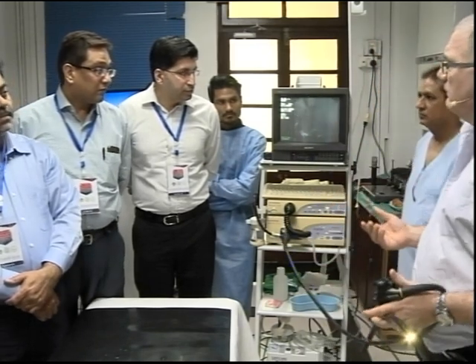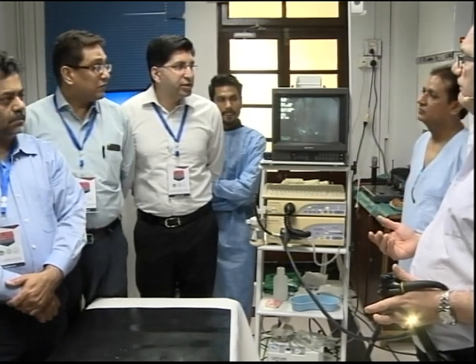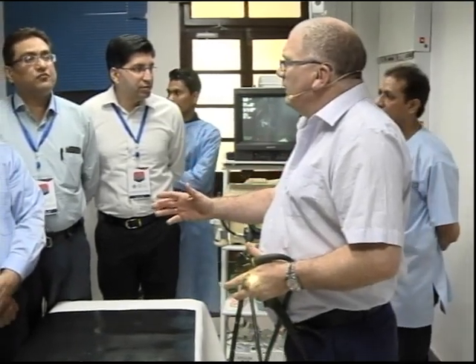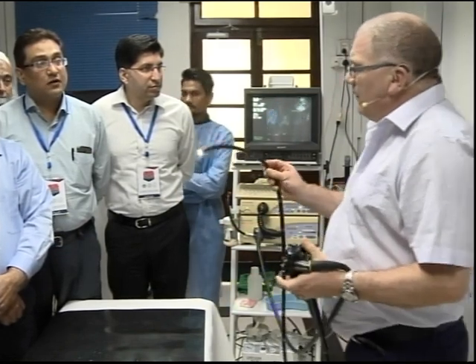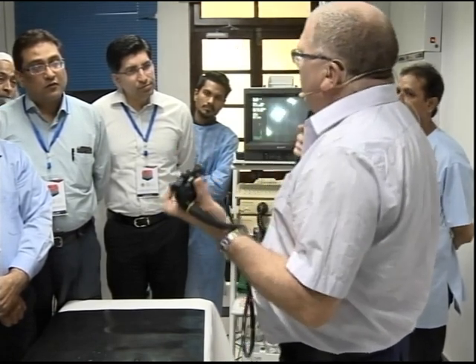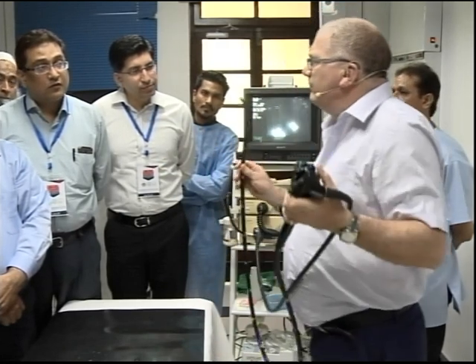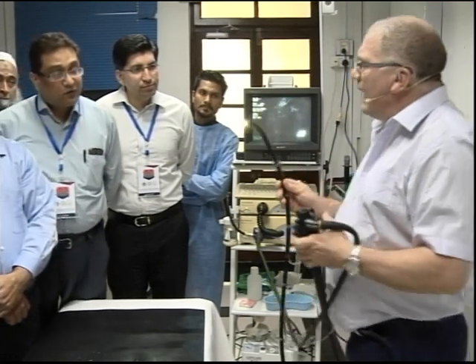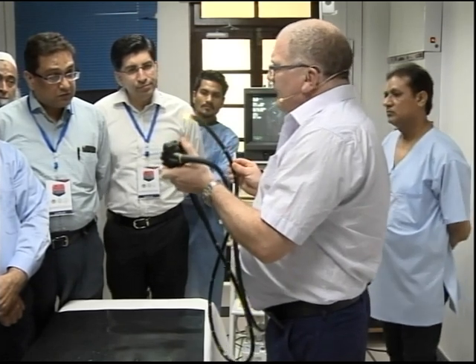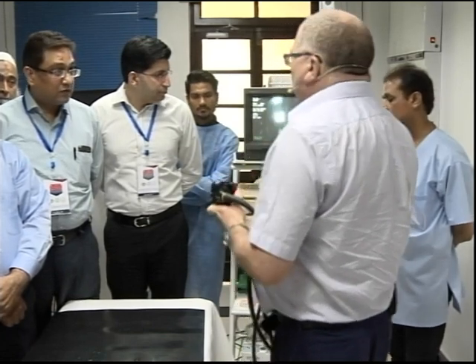Why do we need to know that? Nothing to do with lesions. Orientation within the lumen. But what's the important thing to do? Why is it that we want to know what the big or the larger wheel, the up-down wheel, is doing? Why is it that we need to have the orientation and understand what the big wheel is capable of doing? Why is it that we always want to be able to understand this?